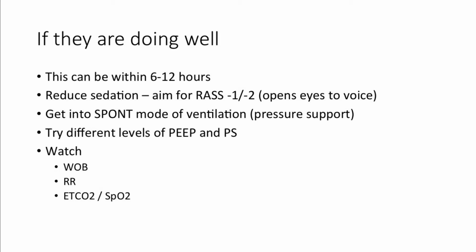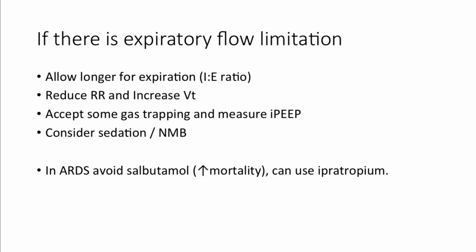And then I've got a whole series of slides about troubleshooting. So if there's expiratory flow limitation, like they've got underlying airways disease, obviously you need to give them long to breathe out.